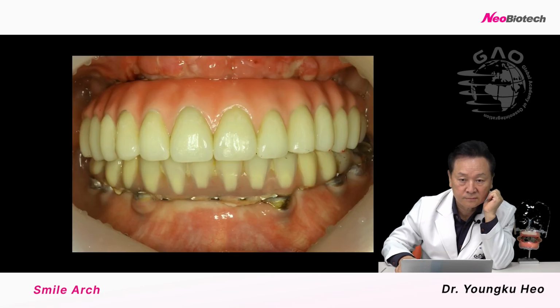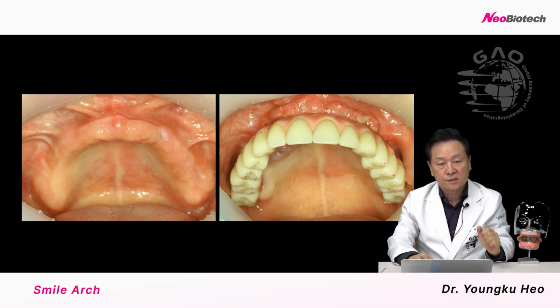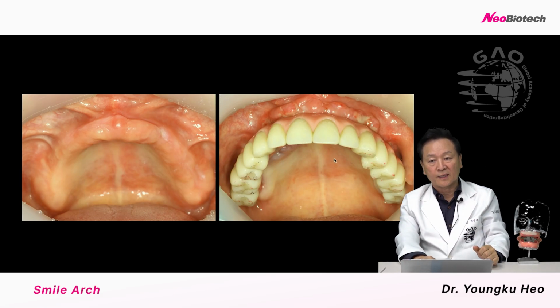Like this. So this is before and after 5 days. We can deliver the final restoration like this.